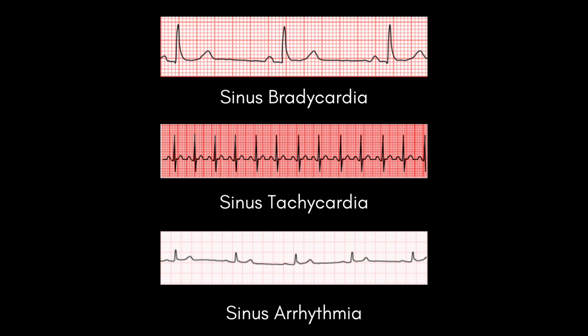Sinus tachycardia describes a heart rhythm where the rate exceeds the normal range of 60 to 100 beats per minute, BPM, stemming from an increased discharge rate of the sinoatrial node surpassing the upper limit of normal activity. Sinus arrhythmia, also known as regularly irregular sinus rhythm, is a deviation from normal sinus rhythm characterized by variations in the PP interval, the duration between consecutive P waves, exceeding 10%.